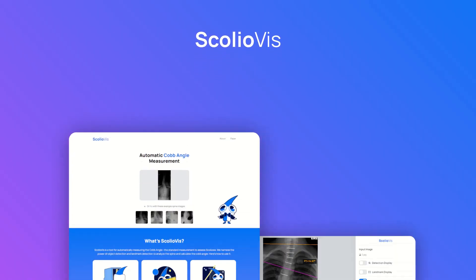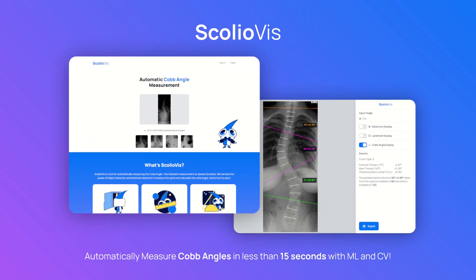Introducing ScolioViz, the automated Cobb Angle measurement tool for anterior-posterior spine x-ray images. We harness the power of machine learning and computer vision in order to analyze what your spine looks like and extract the Cobb Angle values.